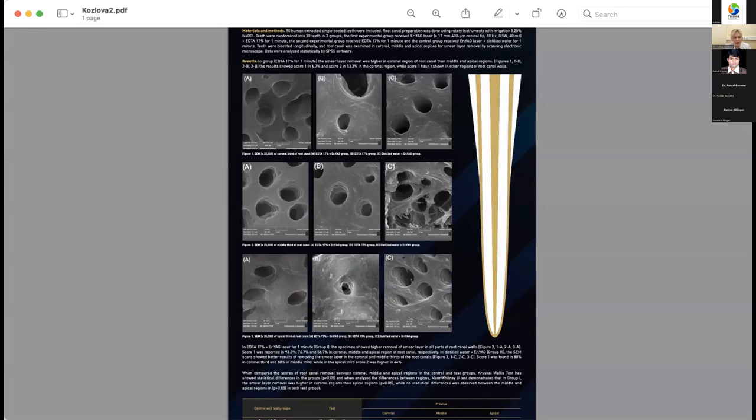On the other hand, laser treatment has proved its efficiency in endodontic treatment, and it was demonstrated that the erbium YAG laser is the suitable laser for cleaning and disinfecting the root canal, due to the absorption of its wavelength by water and hydroxyapatite without any thermal effect. Erbium laser has been used in different protocols, such as the laser-activated irrigation protocol. It's performed using a thin and long sapphire conical tip within the root canal with vertical movements.